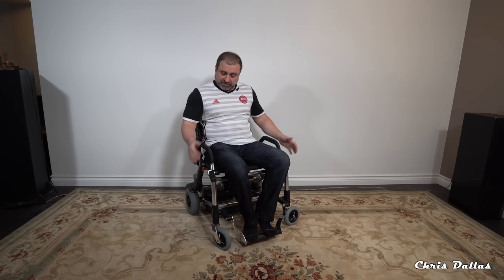Once you fold the chair, the brakes automatically engage on the wheels — the safety brakes. To release the safety brakes you just pull up, and now they're released and you're ready to go.